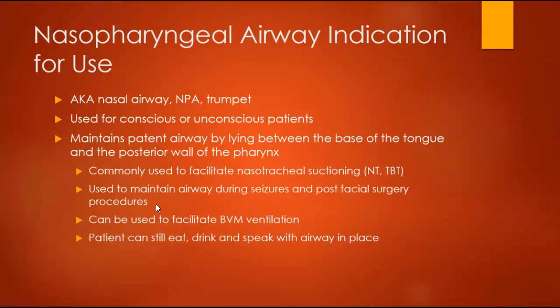Seizures, again, if your patient is seizing, usually during seizures, patients will bite down really hard. So you literally won't be able to get anything in their mouth while they're mid-seizure. So that's why it's easier to facilitate putting the nasal trumpet in. If your patient's at risk of seizures, you wouldn't want to necessarily have an oral airway in, just because as the patient bites down on that, it could possibly break and aspirate something. So you don't want to have anything in the patient's mouth when they're seizing.